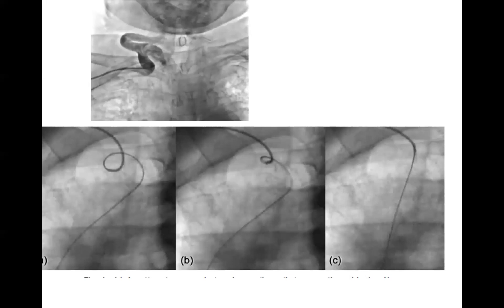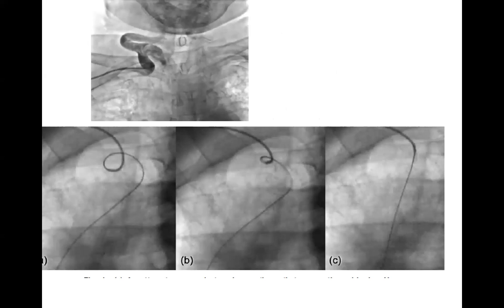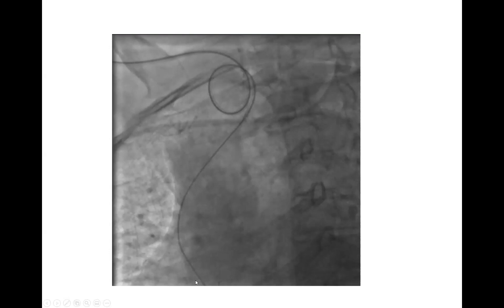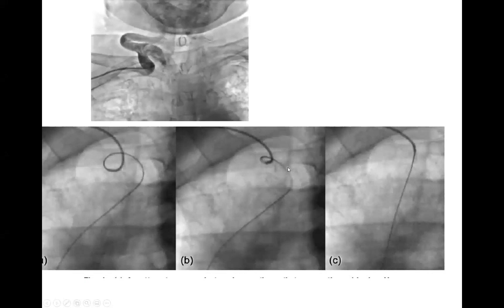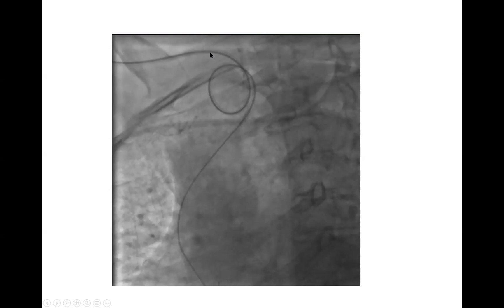After you cross the innominate loop and get down, pull on the catheter and ask the patient to take a deep breath — that will straighten the tortuosity. Sometimes pulling after you cross it also straightens it. Another issue is when the catheter and wire keep going to the descending aorta — that's easier to deal with. Ask the patient to take a deep breath, position the catheter in the aortic arch, counter-clock it to make it point in the right direction, then ask for a deep breath and push the wire down.